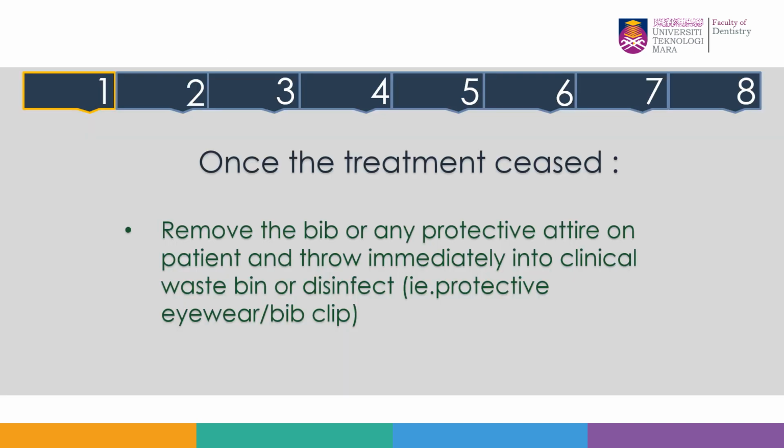Okay, once the treatment has completed or ceased, remove the bib or any protective attire on your patients and throw it immediately into the clinical waste bin, or disinfect those which are not disposable. For example, the goggles or protective eyewear and bib clip.